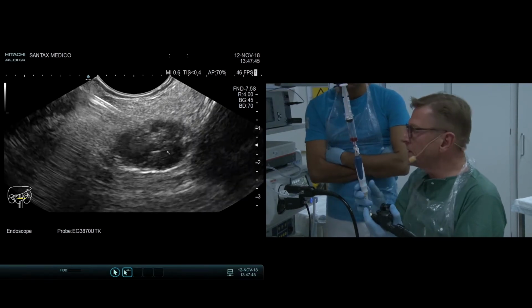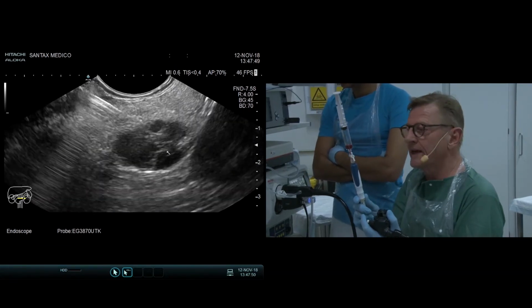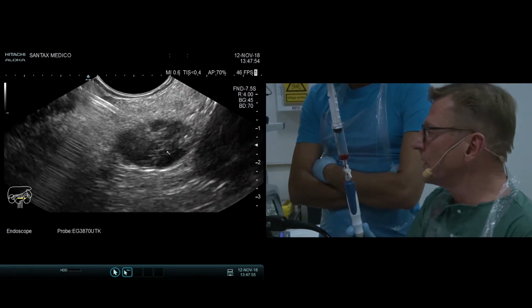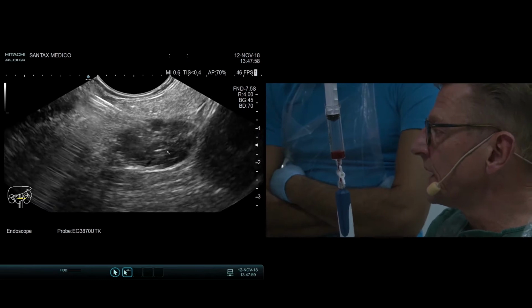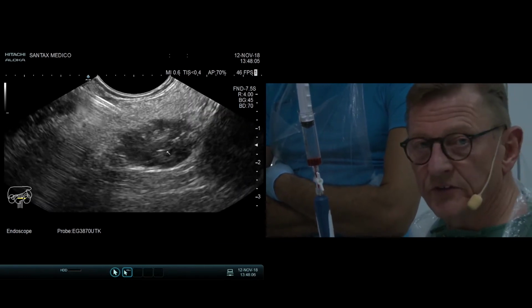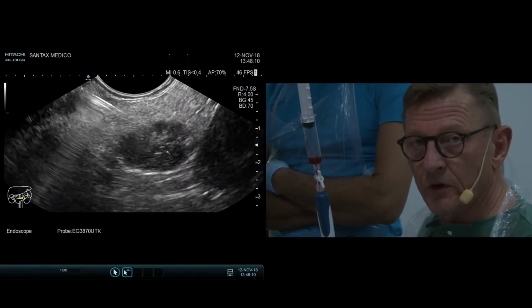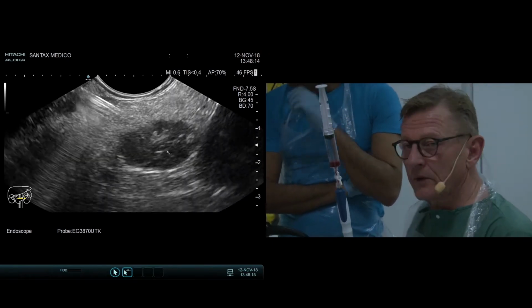Basic, that would be our choice. But as I told you, very often we are unable to get enough fluid. This is coagulum, so I think it's fine with this. And we have to see. We will present all this material as much as possible tomorrow, so that we can discuss how it looks.